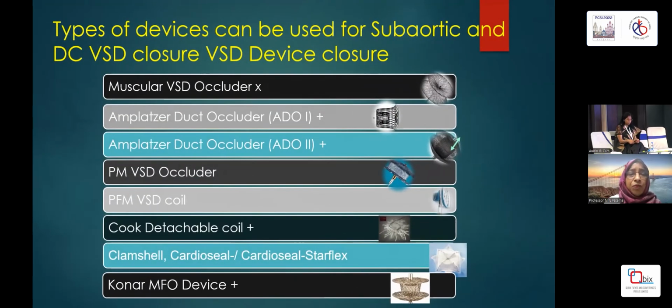What types of devices are we using for these kinds of VSD, which are very close to the valve? We are not using muscular devices. This is cross. We are using duct occluder one in some of the cases which are very large.